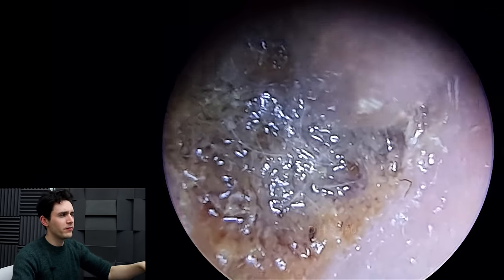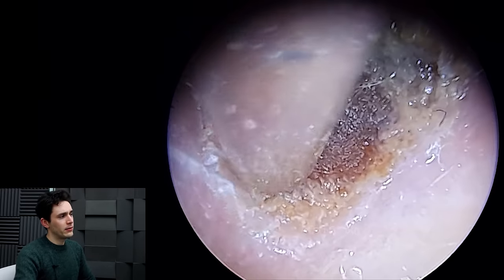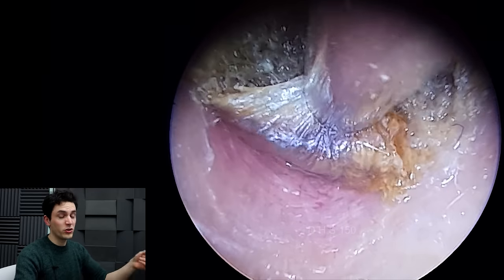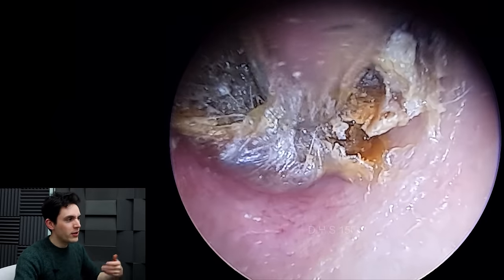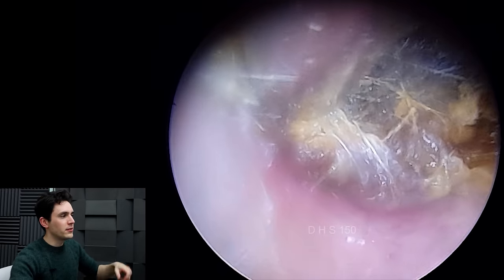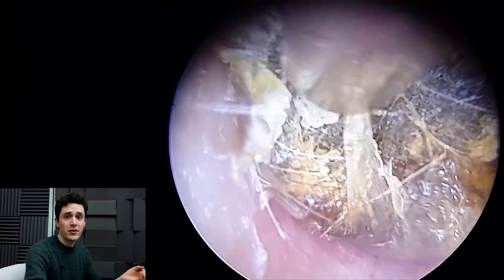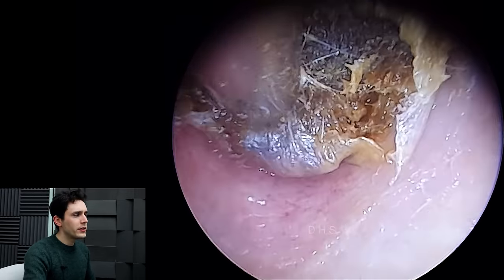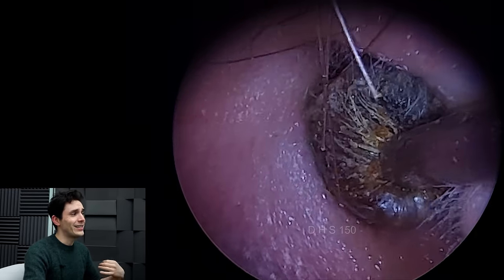The scene has been cut. You can see everything looks kind of moist now. That's because I irrigated it for a minute with water. I'll upload another video of me doing that, but essentially we're just squirting water into the ear for a minute and holding a cup by the patient's ear. It's similar to the classic syringing method, except we're using an electronic machine to achieve that. It's much safer, it pulses water at a steady, quite low flow rate. And what this does is, as you can see, it just loosens everything up nicely — turns difficult jobs into easy jobs.